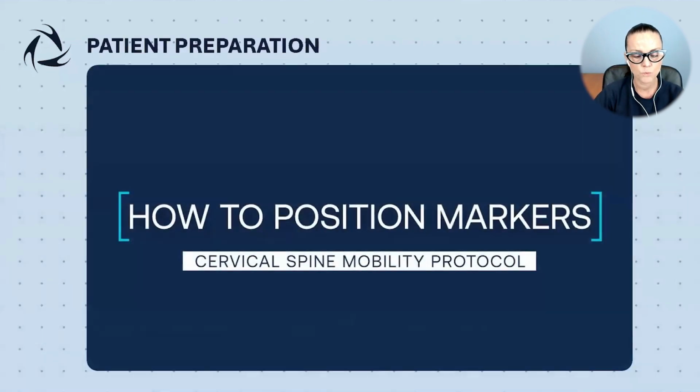Now, let's watch the video that explains how to correctly apply the markers on the patient based on the cervical spine mobility protocol.